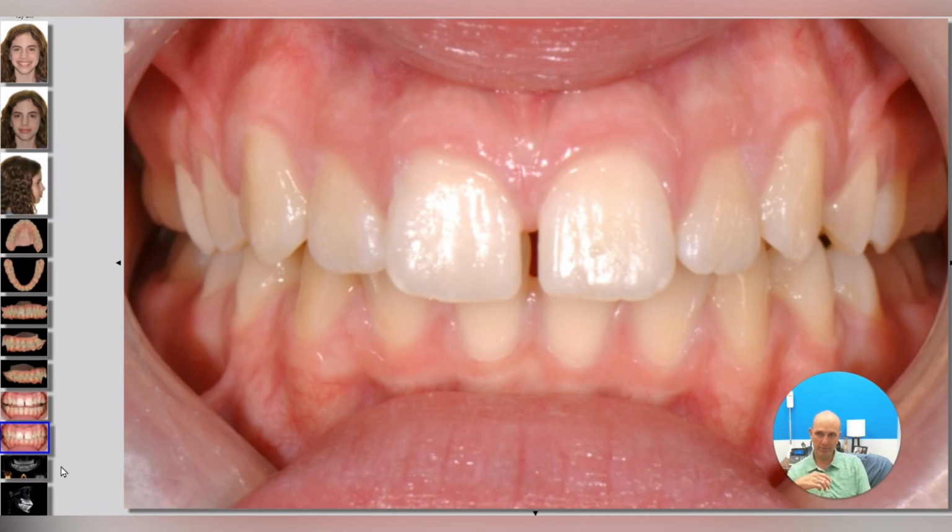We don't take any other intraoral images. We use all of those images if we need to for any aligner, any setup, and I've done that for years. So I know that the intraoral scans aren't necessarily the best quality compared to pictures, but they're getting better and better.